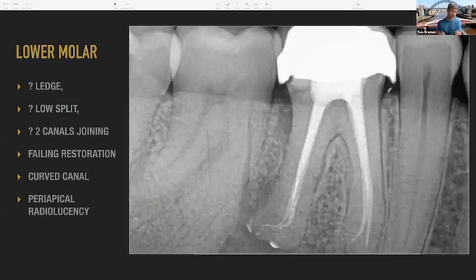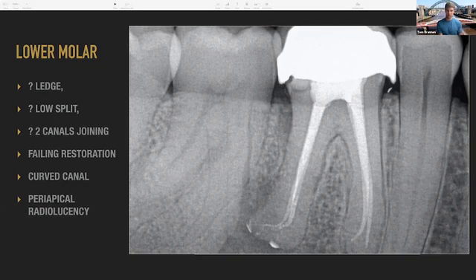It took me I think at least 3 visits. They actually had Thermafil carriers in it as well, and they were wedged in, and they were really tricky to get out. Thermafil, I don't know if everyone watching knows, is a carrier-based obturation. So it's the old style one, which is a plastic carrier with GP around it that you heat in a little oven, and then you're meant to just passively put into the canal. But these have just been wedged in.